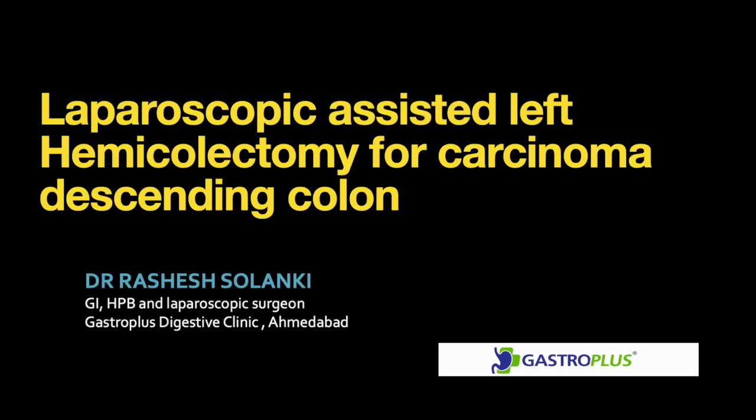This video demonstrates the technique of laparoscopic assisted left hemicolectomy for a descending colon sigmoid junction adenocarcinoma with extracorporeal anastomosis.